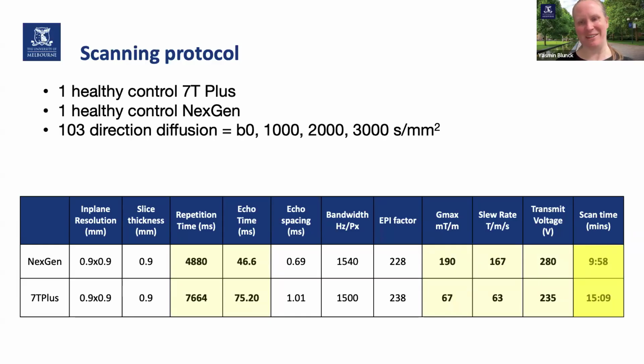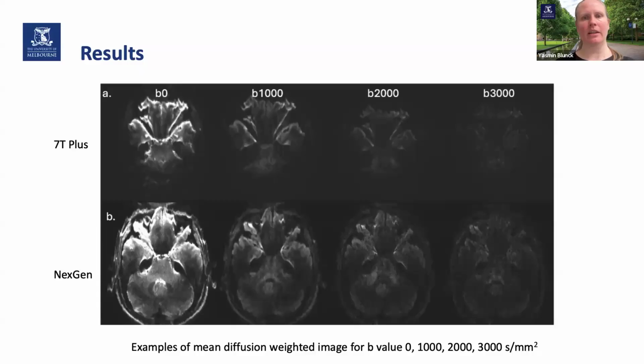In fact, we got under 10 minutes, a magical number, I think, which was very important also for our clinical collaborators because one of them would like to explore pediatric patients in the future. And here we can see the first result that we got from these two scans.